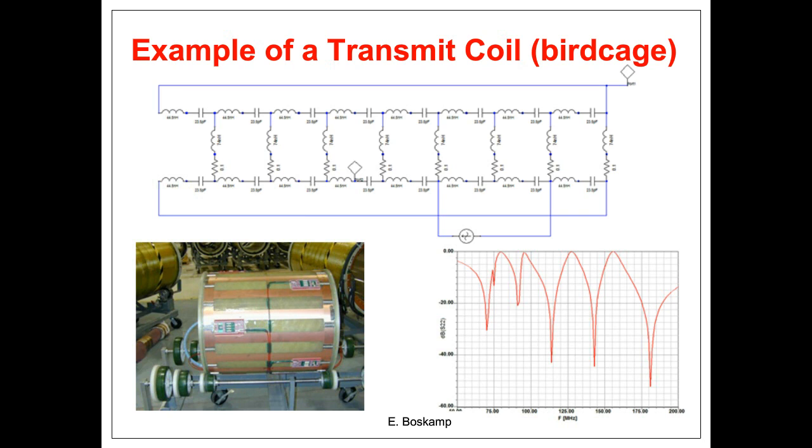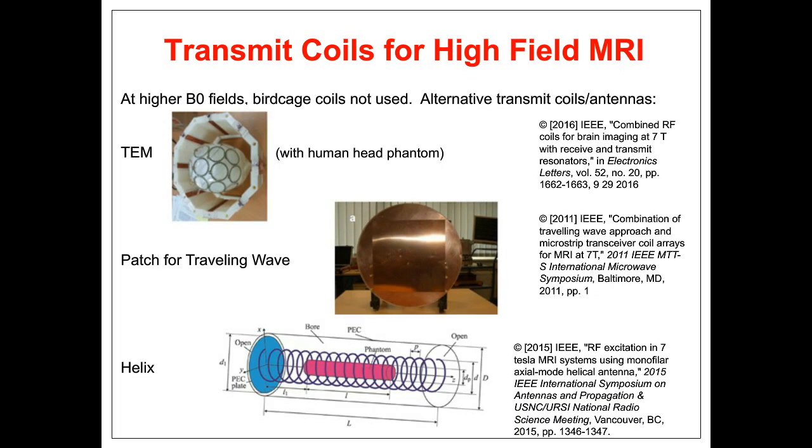For small animal studies, however, the birdcage is still used up to very high field strengths. For the high field strengths that are being investigated now, alternatives to that birdcage are used.